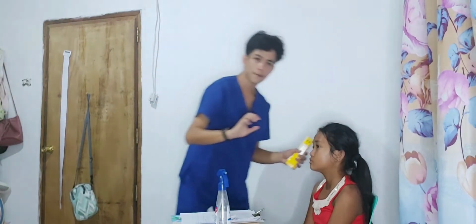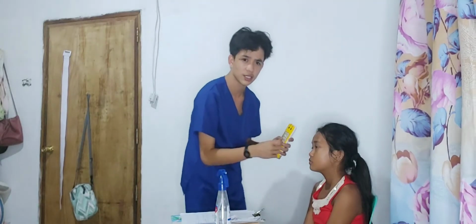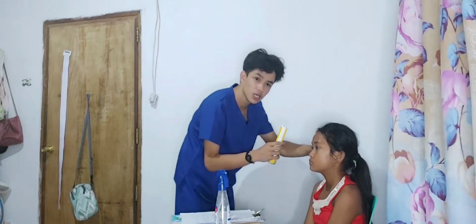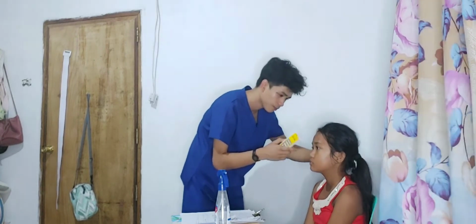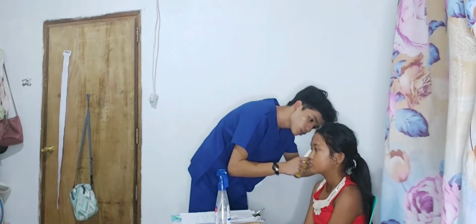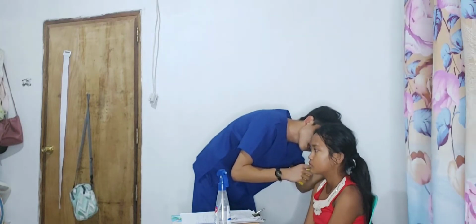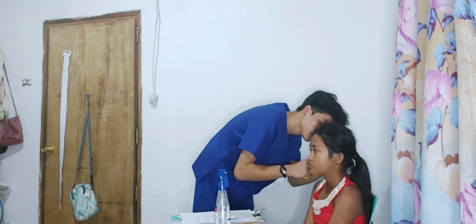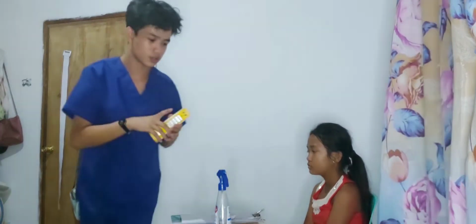usually when assessing the adult, adult na siya, so we're going to pull up the patient's ear and backwards. We're going to inspect the external auditory canal. Note any size, the color, and consistency. Okay, so both ears.